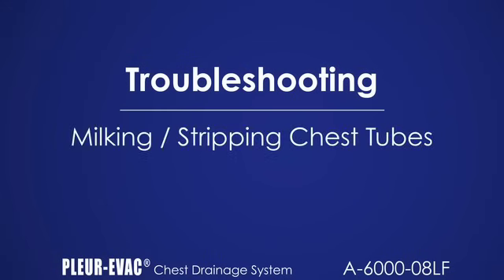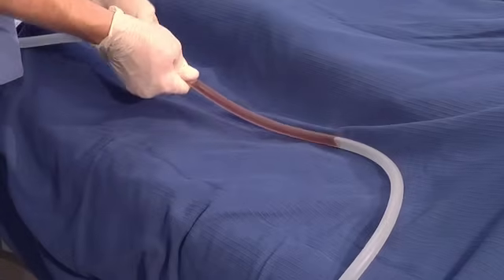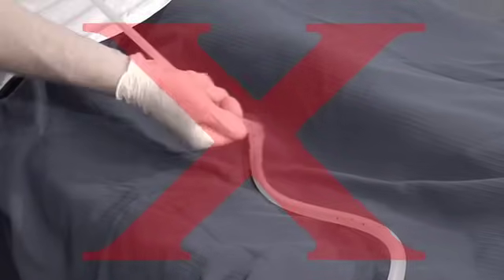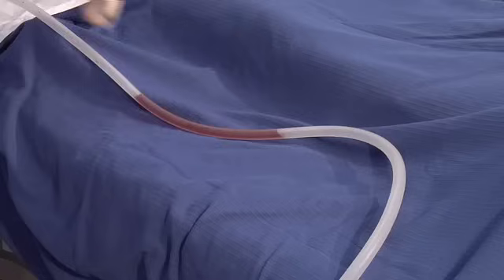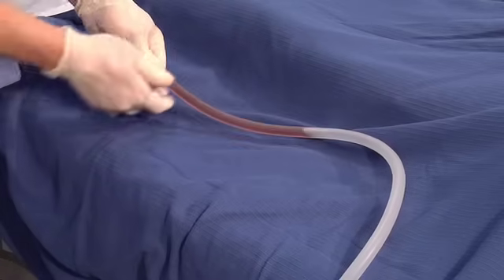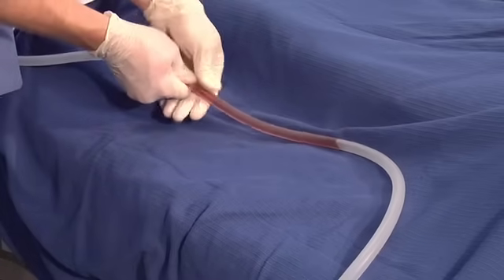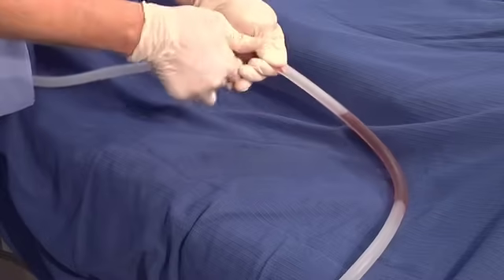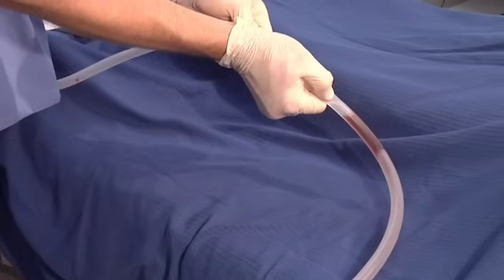When milking or stripping chest tubes, it is important to follow hospital policy. If chest tube stripping is performed, milk the tube in short sections. Avoid flattening of the tube in long sections, which can increase patient negative pressure. Note, stripping of the patient tube must be done with the patient tubing clamp open. Stripping with the clamps closed can result in the buildup of excessive positive pressure.